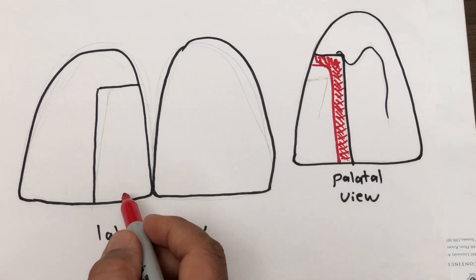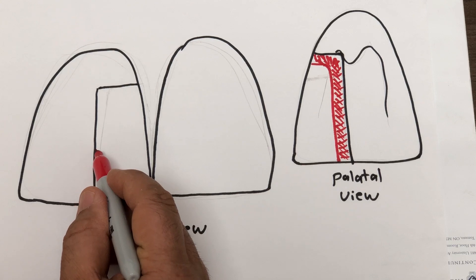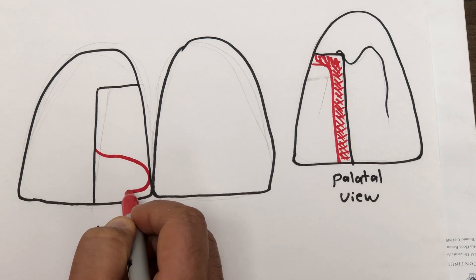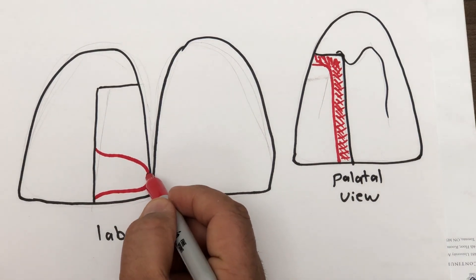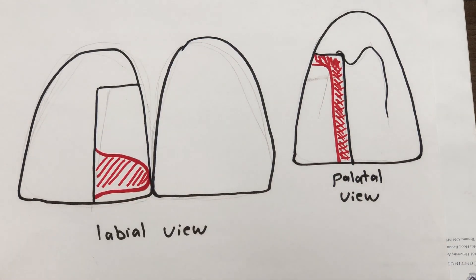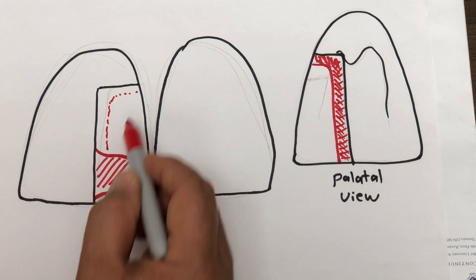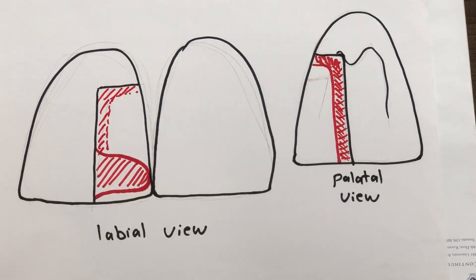After that, we start to build the contact area by applying composite to exactly where we need to have a proper contact area. This composite mass should be in contact with the adjacent tooth — no separation, no isolation media, just keep in touch with the adjacent tooth. At the same time, we've already built up the palatal side of the tooth. This is the second stage, where we build the contact area.